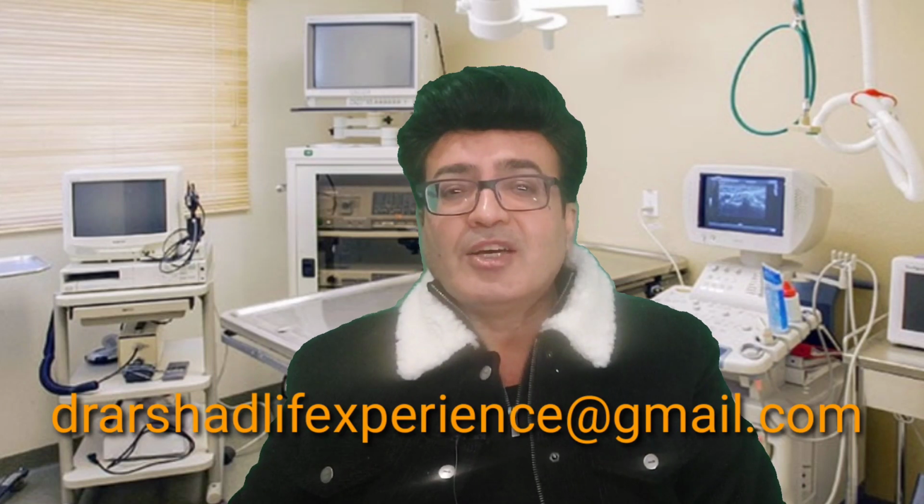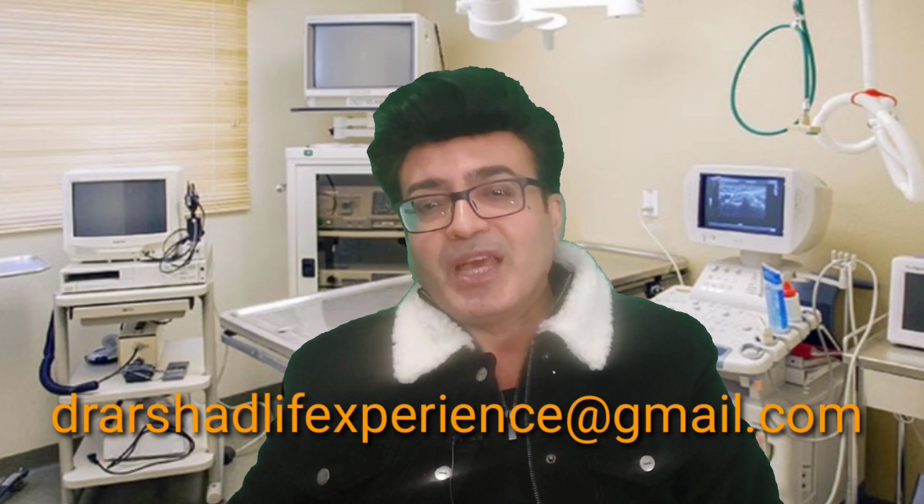This was all about liver cirrhosis, and I hope these images help you find all the findings on the ultrasound images of liver cirrhosis, and that you will be able to write an effective report. Always scan the patients for hepatoma, because most of the time there will be hepatocellular carcinoma lying within the cirrhotic liver. So scan very carefully, because this is a very important organ of the body, and when there is cirrhosis, it means the patient's life is at stake. So be very cautious, rather I would say extra cautious.